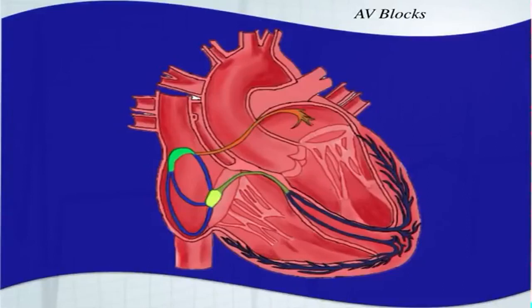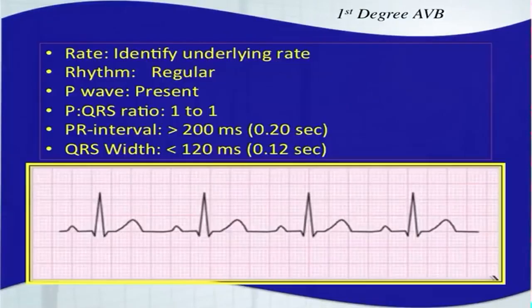AV stands for atrioventricular. So there's a block in the conduction between the atria and the ventricles. And typically, when we're talking about AV blocks, the AV block will occur around the AV node, just like a junctional rhythm. The pacemaker is around the AV node or the AV junction. With an AV block, you will have a block in this conduction pathway between the atria and ventricles in that same area. But you could still have a sinus rhythm beating, depolarizing here from this sinoatrial node, and it's just getting delayed once it makes it to that block. Okay? There's just a delay right here somewhere that's slowing things down or causing an interruption in that conduction.